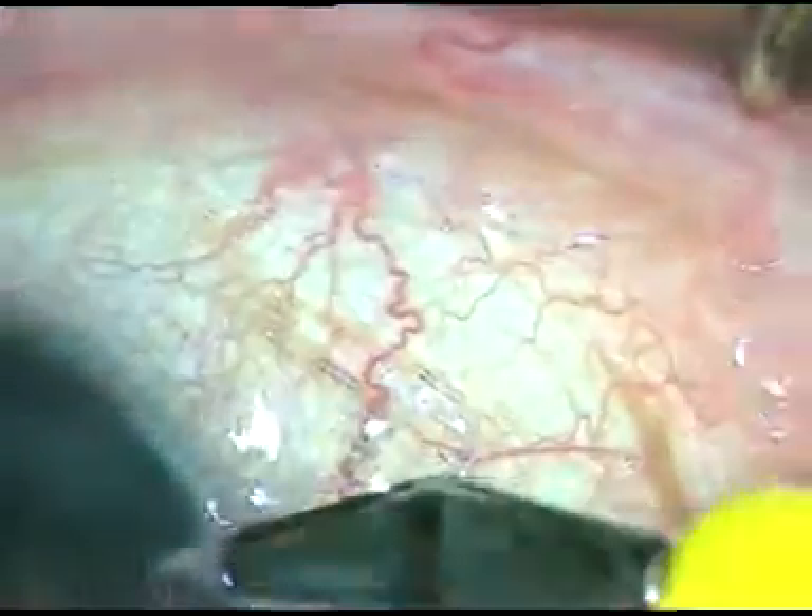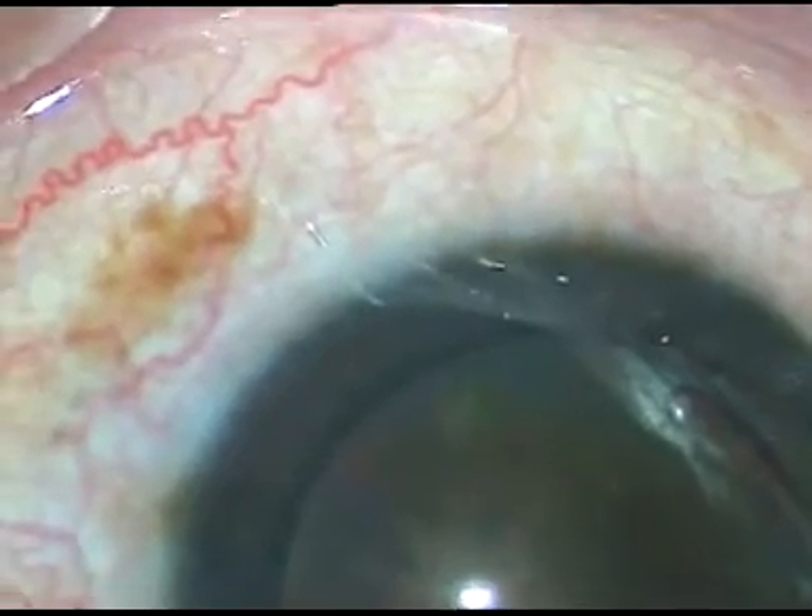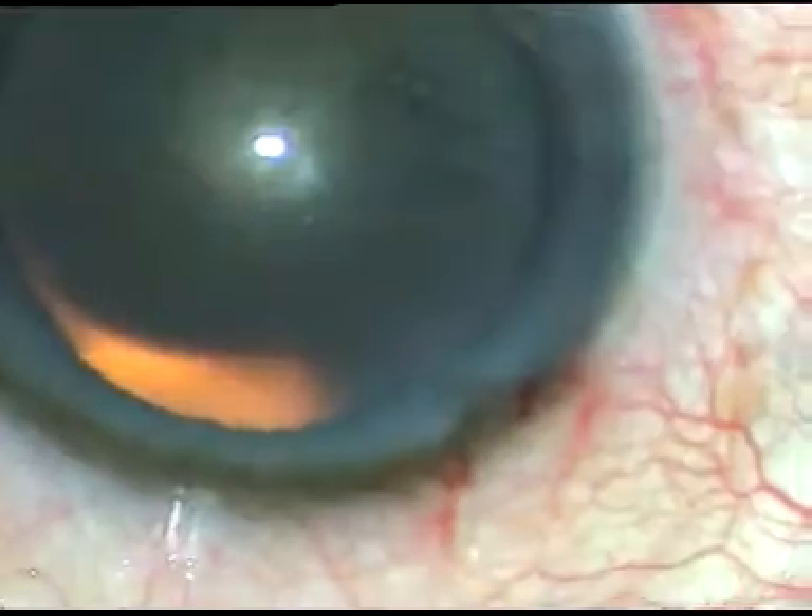Dear colleagues, this is a very soft cataract, and in such cases, I usually manage the nucleus by my lens tilt technique.